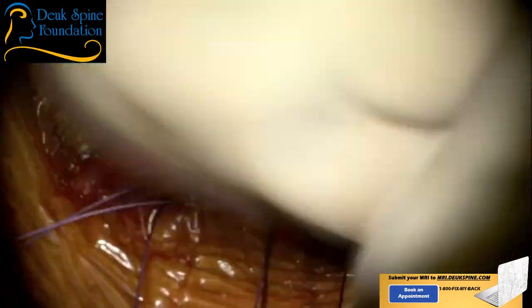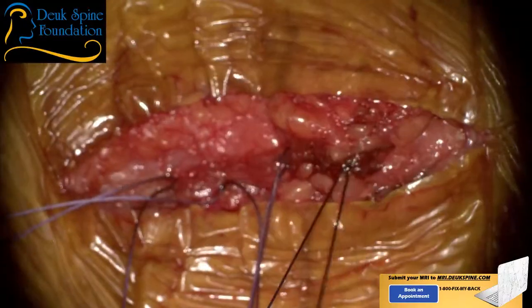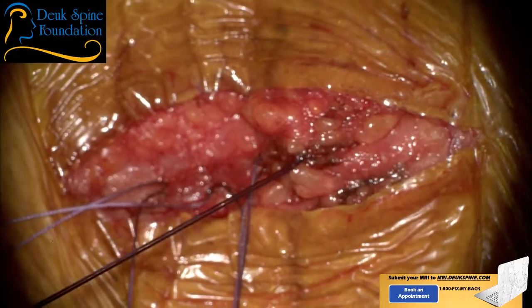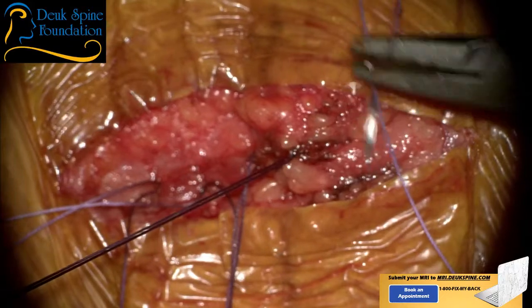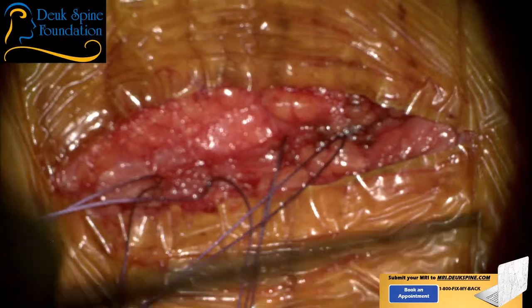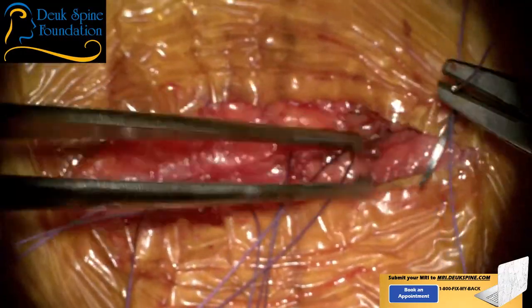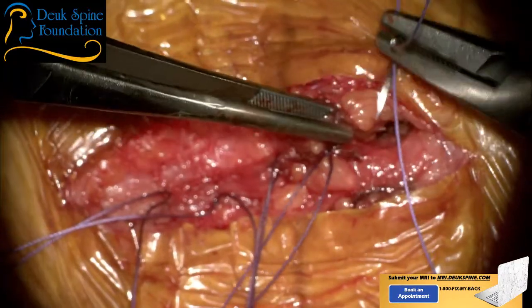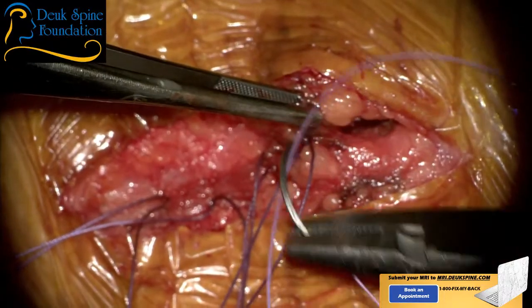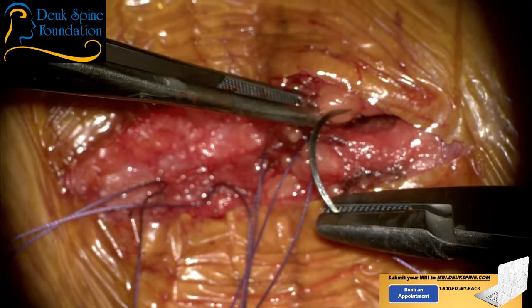It's weird sewing under the microscope, isn't it, Dr. Patel? Let me have one more suture. Okay, watch your hand. So, let me have a pickup. I was hoping to be able to do it that way, but I just want to get the bottom of the incision here. Because sometimes gravity, right? What's going to happen? Everything's going to come down this direction. And then the patient's going to have a little bit of leakage.